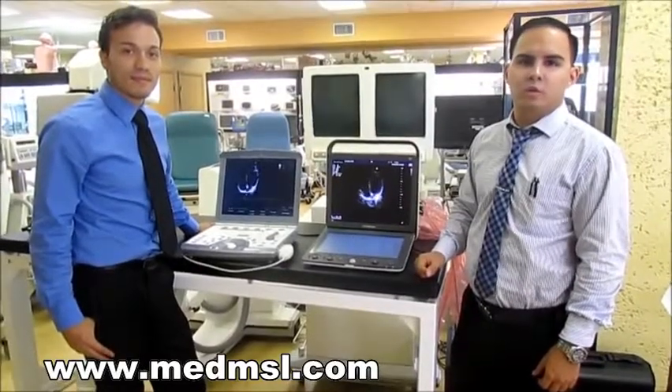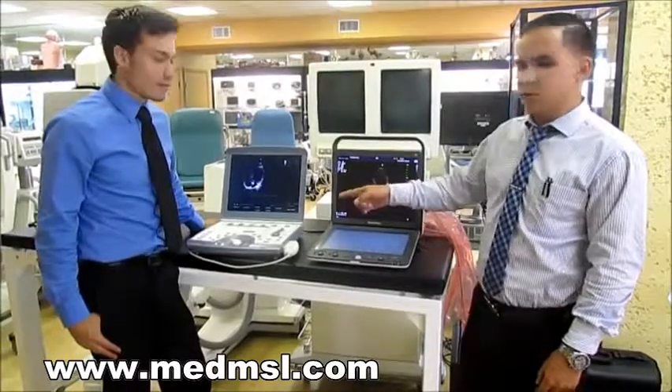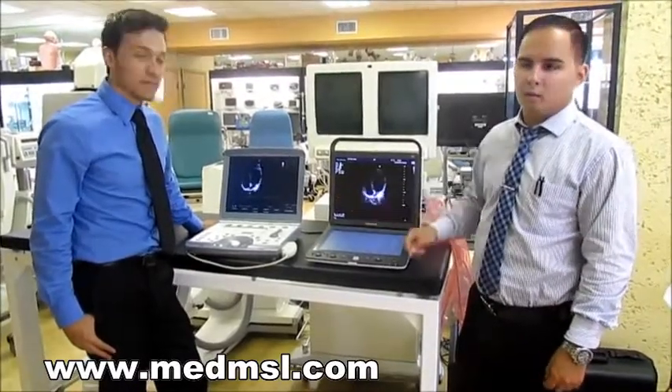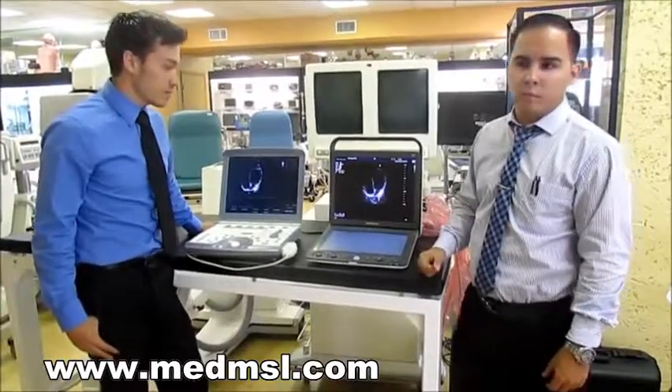We're here to talk to you about diagnostic ultrasounds. We're going to compare our brand new Sonoscape S9 versus the GE Vivid Eye — both cardiology ultrasounds — and I'm going to let George tell you a little bit more about it.